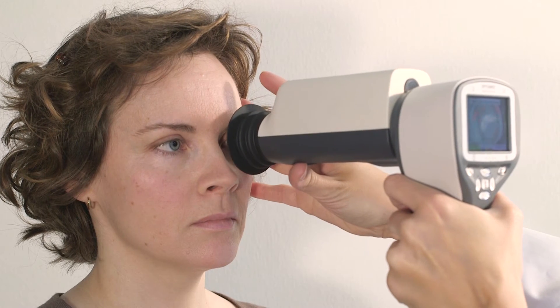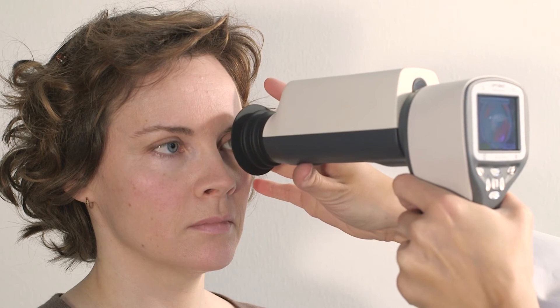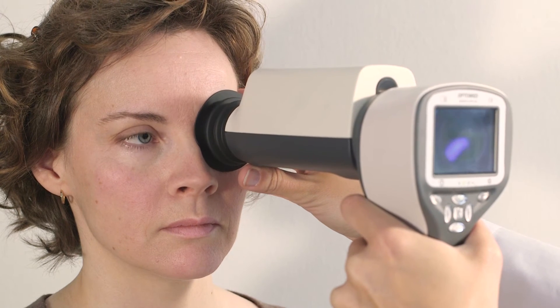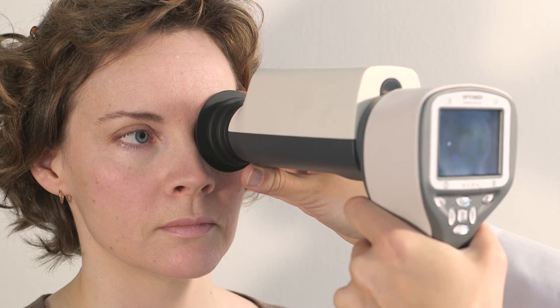Start approaching the eye from about 10 cm distance. Keep the pupil in the center of the display and approach until you can see the reflection from the retina, which appears grayish with infrared light. The infrared aiming light is automatically on by default. Keep the view of the retina in the center of the display and close in slowly until it fully fills the viewing area. If adjustment is needed to recenter on the pupil, adjust the module with the hand supporting the optics module using only very small movements, as it is easy to lose the target. If the view is lost, just withdraw the camera a few centimeters and realign to the pupil.